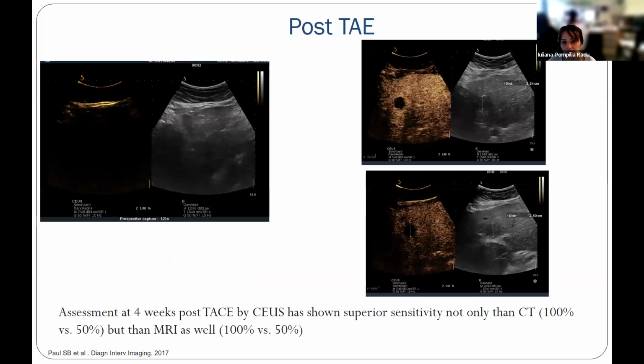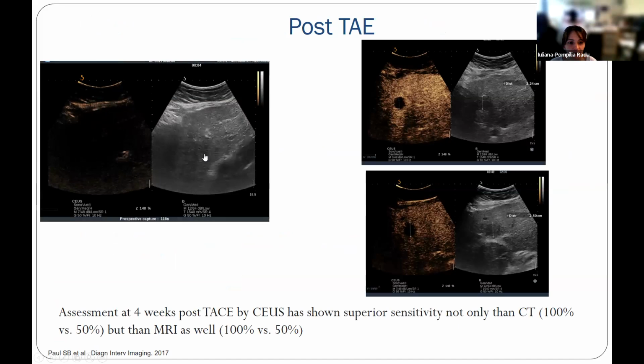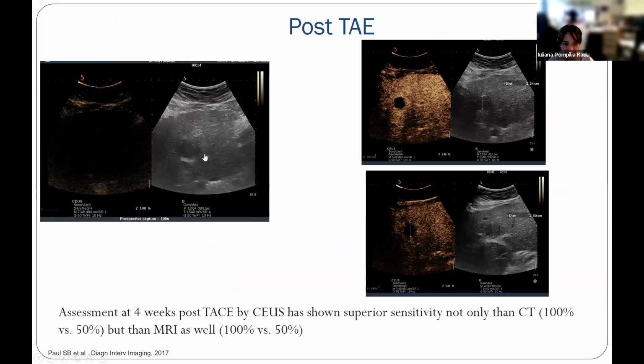So, post-TAE, again, we have also, it's used to detect the residual tumor. And here sometimes contrast scores a bit higher than MRI and CT in the beginning, in the first month.